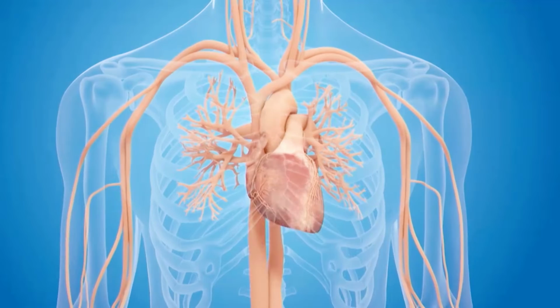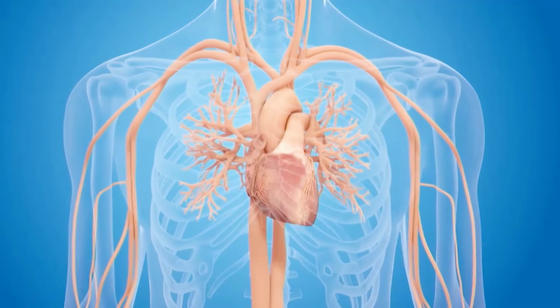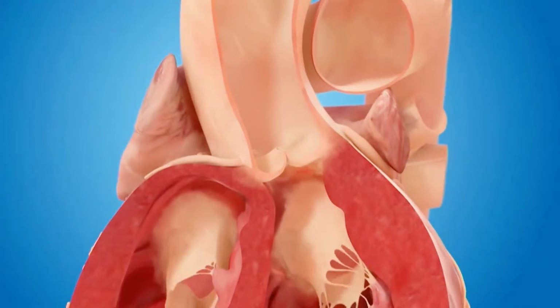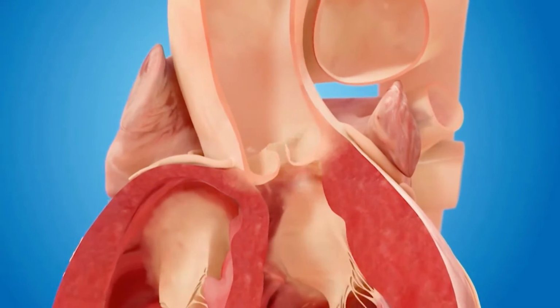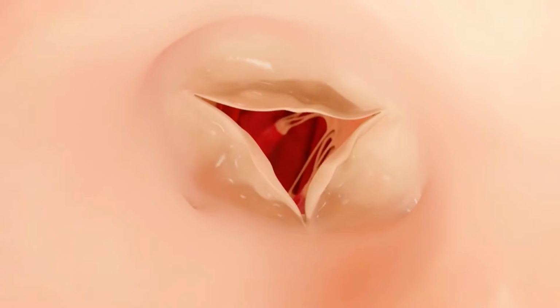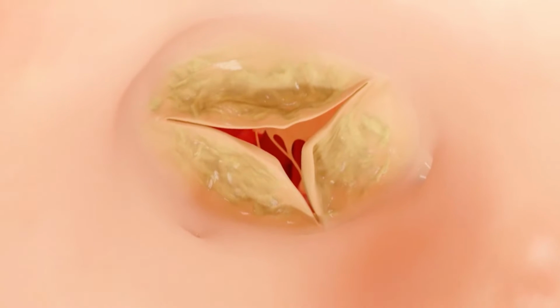home the next day. So here is a computerized animation of a chest where we're focusing on the heart, and what you see there is the valve opening and closing, and this is an animated representation of a healthy valve. And here now you see a little bit of green, and it's not very happy, it's just sitting there and fluttering. And it's a fairly good representation that the valve is not opening and closing.